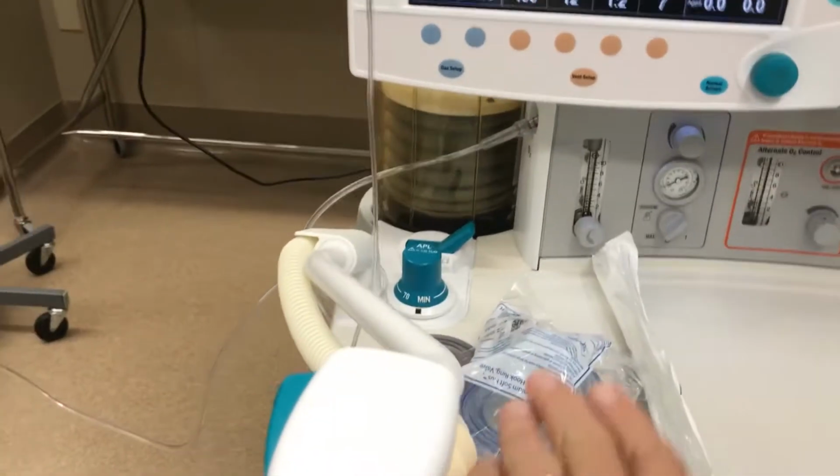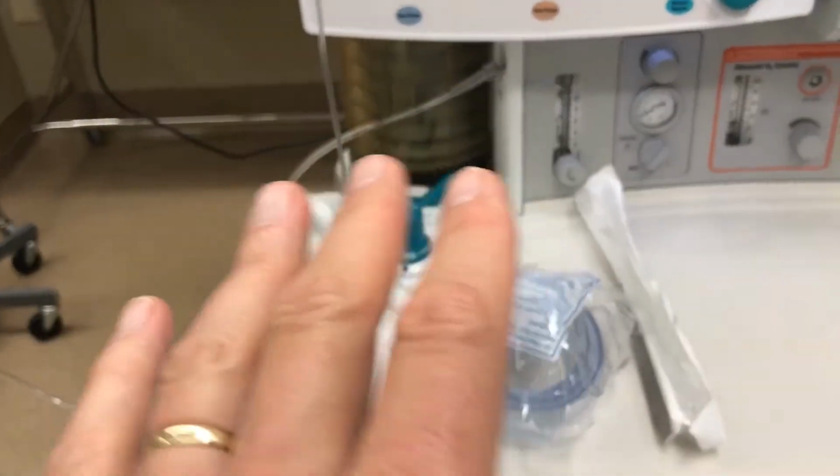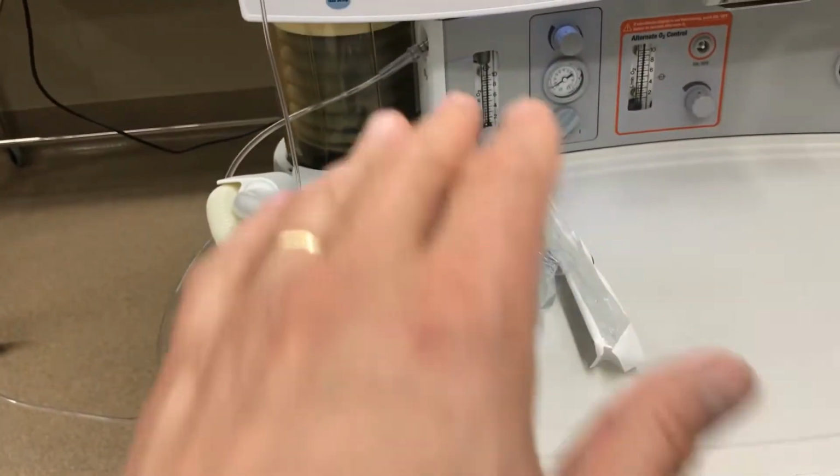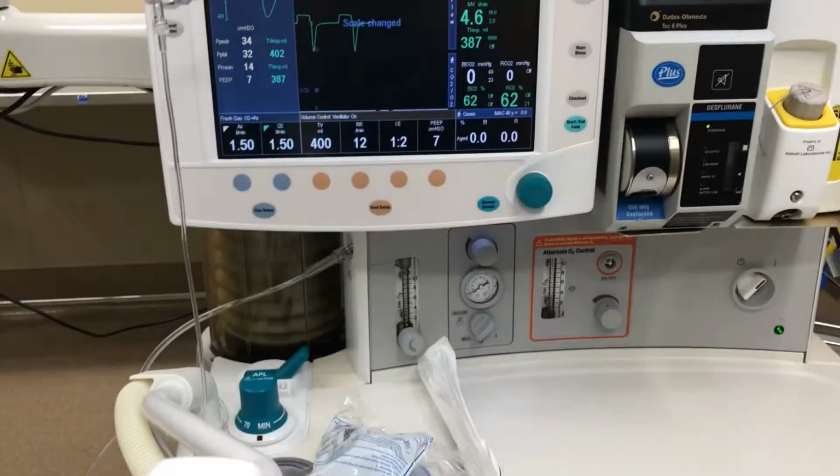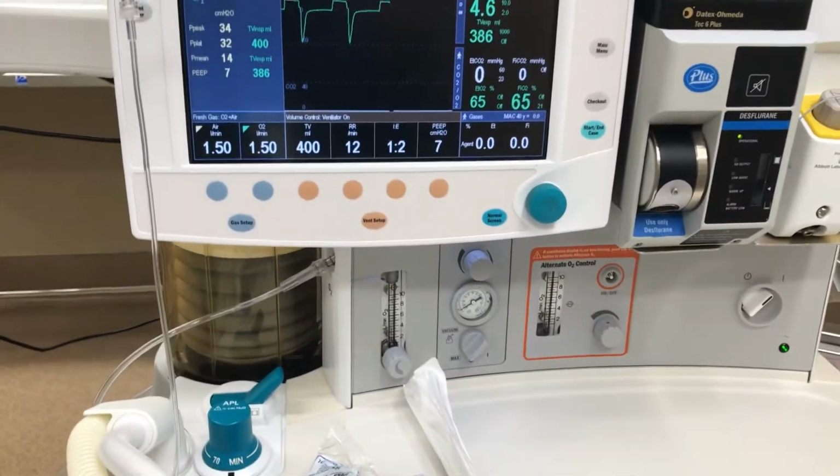These are capable of manual ventilation, but it's a very odd interplay of using this valve and the bag. If you have to bag the patient, just use a standard BVM.